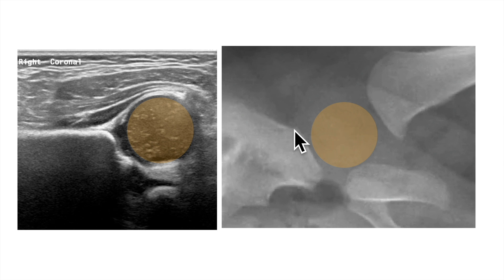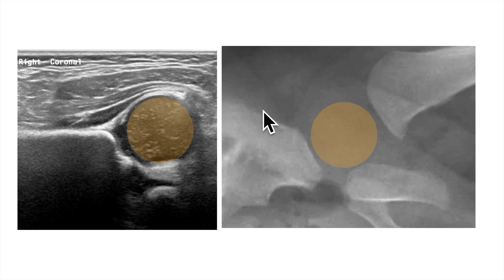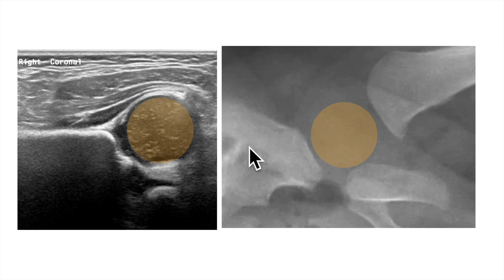Here the iliac bone is angled supralateral to inframedial, and here it's straight because this is actually taken slightly posteriorly. This angulation that forms between the iliac body and the acetabulum gets gradually less and less and becomes more vertical as we go posterior. To illustrate that, I'm going to show you a clip from a CT scan at the end of this part to convince you that this really is straight the further back you go.